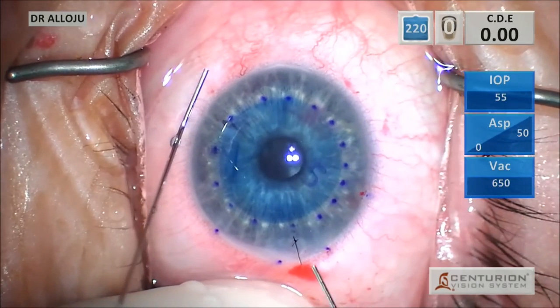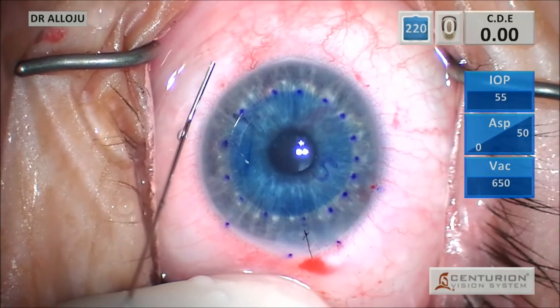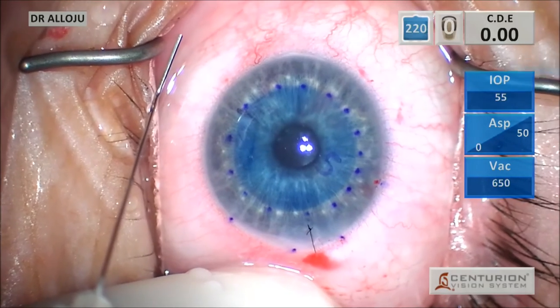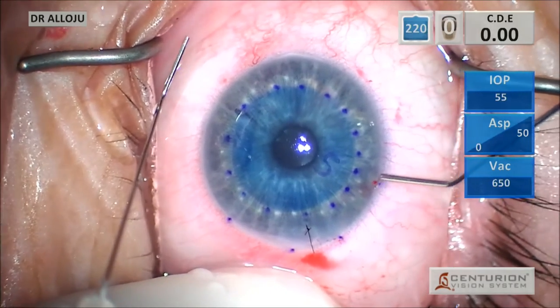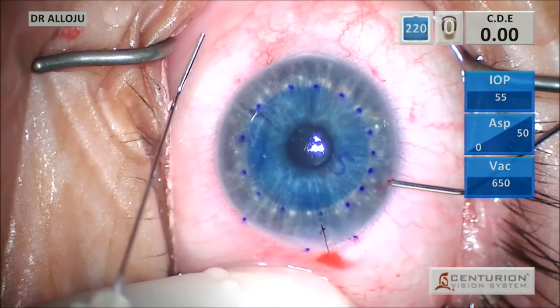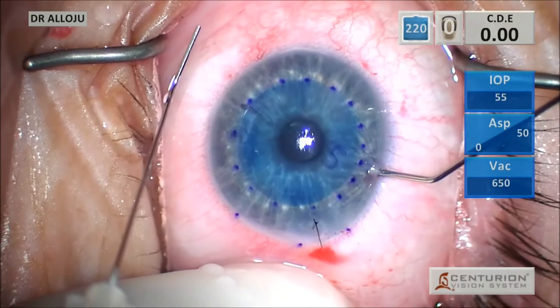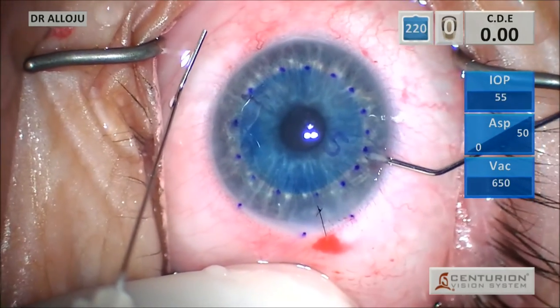Now, to move the graft, you can actually tap it at this stage in the direction that you want to move it, and it should move. You can also employ some negative pressure movements, kind of like what I did before, to also help it move. Now, once you've got this, I still don't want the graft to shallow because it may end up folding along the edges, so I'm still exerting pressure with my middle finger.